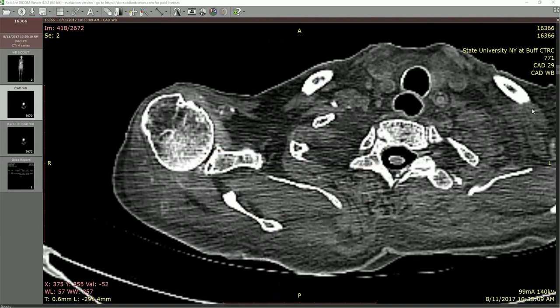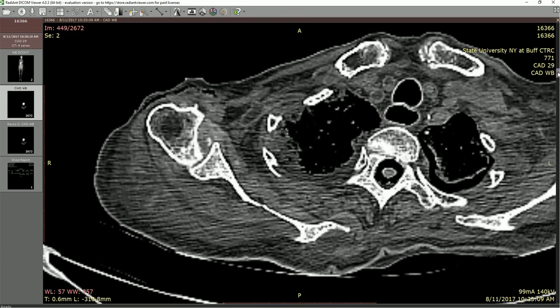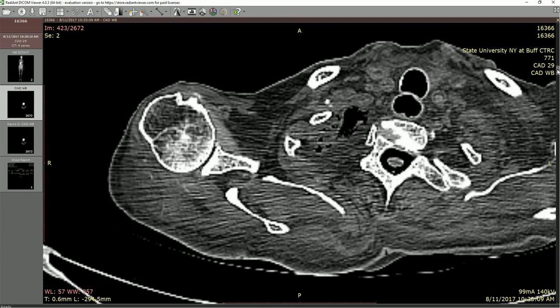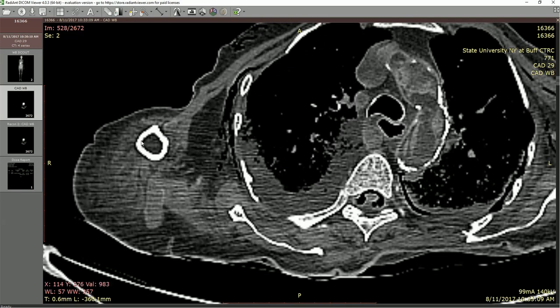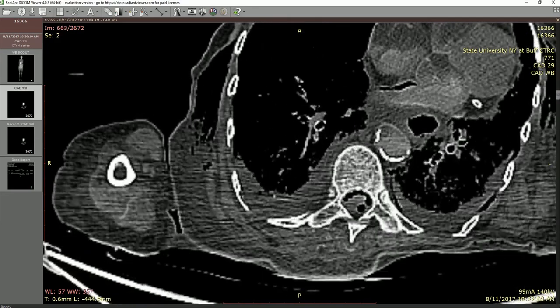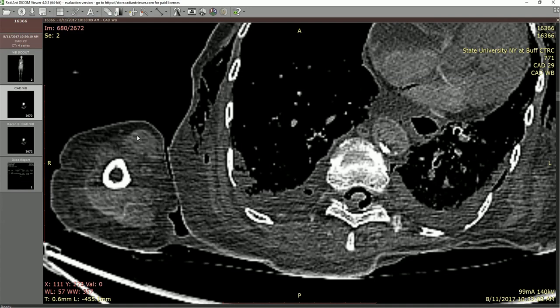Here we are on the individual's right arm and we're going to scroll down. Here's the humeral head. Scrolling inferiorly takes us into the humeral shaft where we see lightly colored bright compact bone and a little bit of cancellous bone with bone marrow in the middle. Moving down to the mid-humeral region, you can pretty clearly see the anterior compartment of musculature and the posterior compartment, which would be made up of the tricep. Everything on the outside is cutaneous tissue — this individual has a bit more subcutaneous fat, which is why we're seeing such a thickened area.